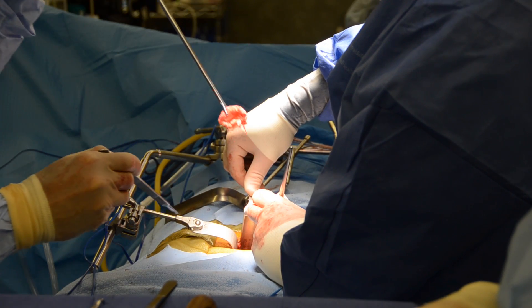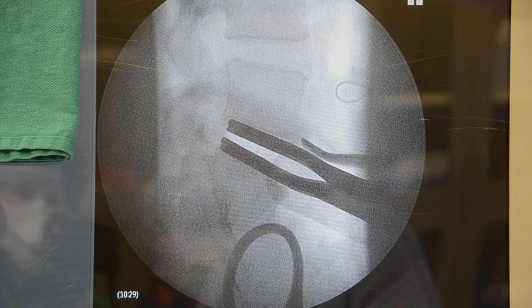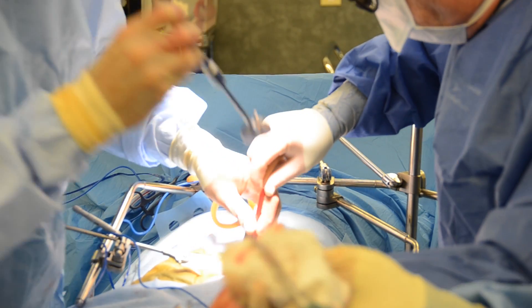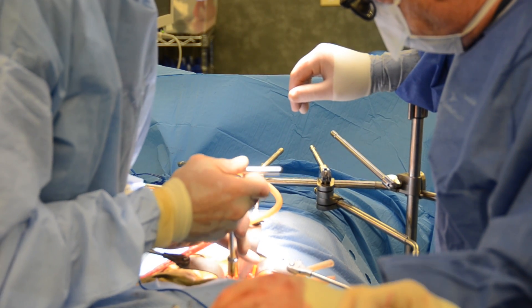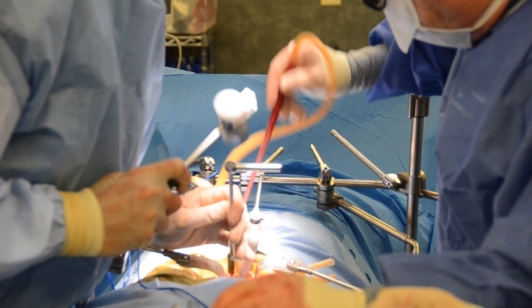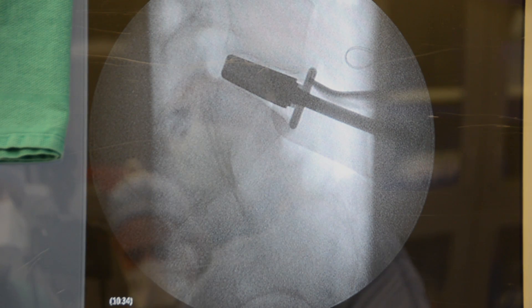The damaged disc is removed and the disc space is prepared for disc arthroplasty. The disc space is distracted open and it's important to have parallel distraction. The top of the trial is tapped into position to get the appropriate size for the artificial disc.